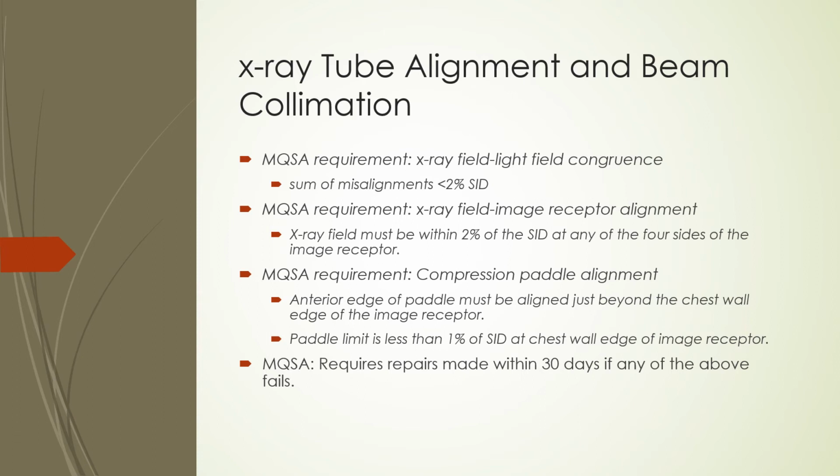MQSA regulations require repairs to be made within 30 days if the light and X-ray field alignment, X-ray field and image receptor alignment, or compression paddle alignment is out of tolerance.